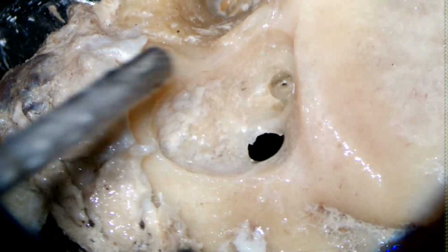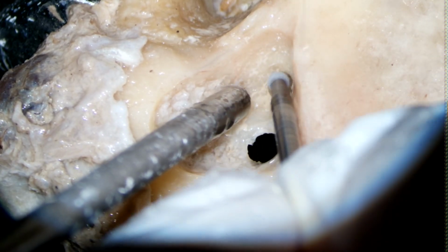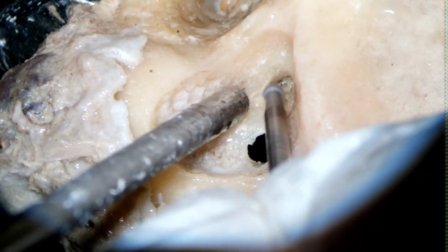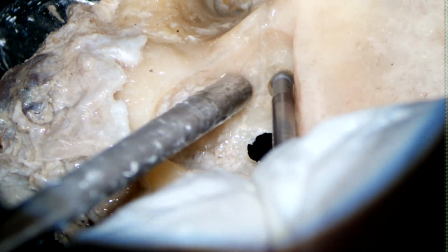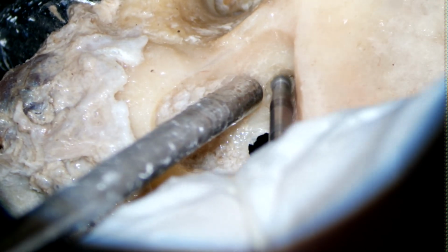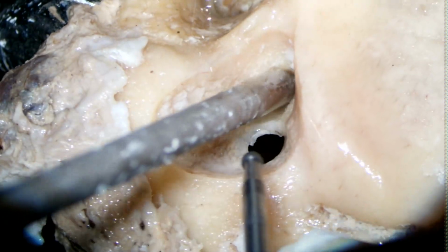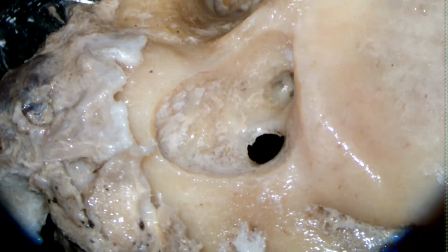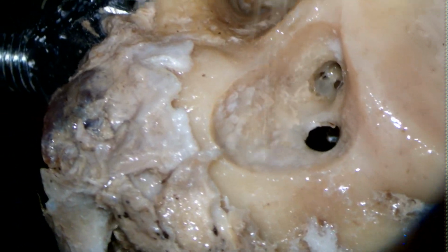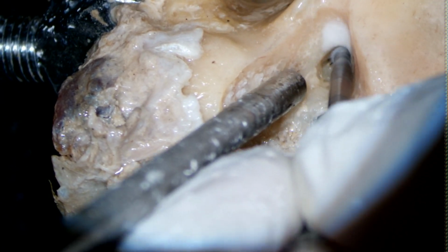Sometimes you can have Koerner's septum. So when you are opening, you might encounter Koerner's septum, and in that case, the antrum, the false cavity, will not be actually communicating with the middle ear through the aditus.